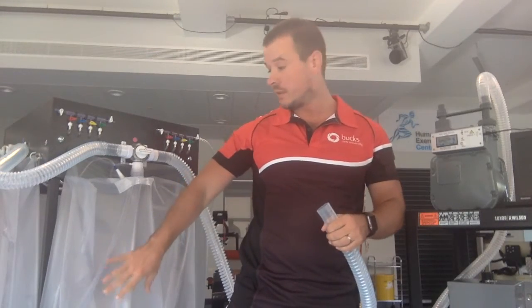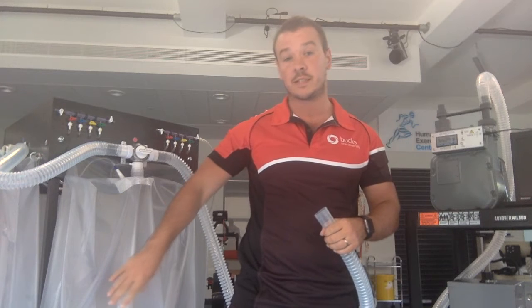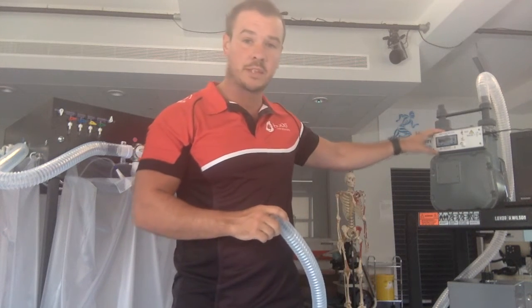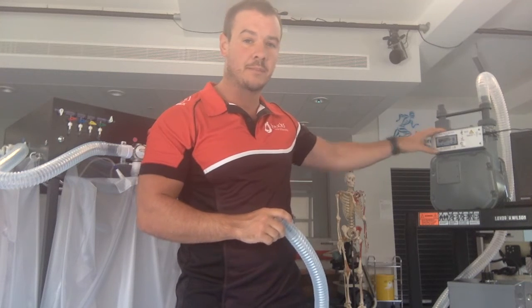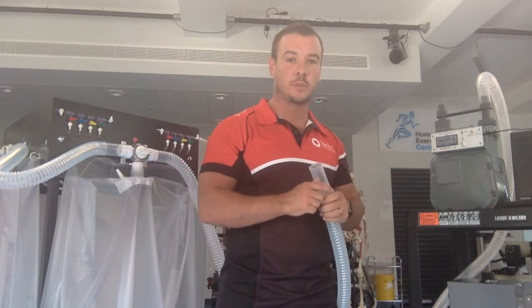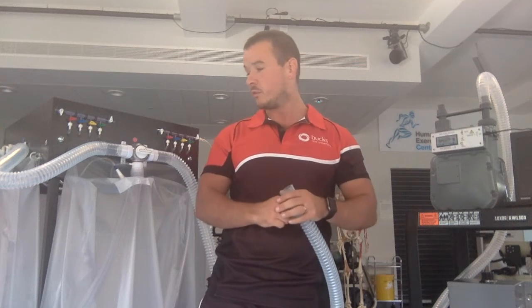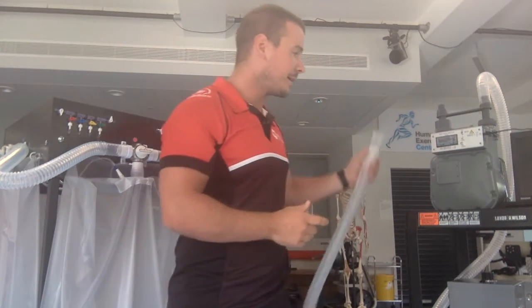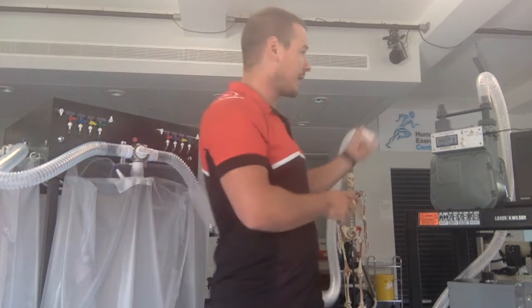Now that I'm confident that the Douglas bag contains exactly nine litres of air, I can check the accuracy with which this is measured by the dry gas meter. Take the end of the plastic tubing that's attached at one end to the red Douglas bag and that's just been attached to the Hans Rudolf syringe, and attach it to the inlet valve of the dry gas meter.